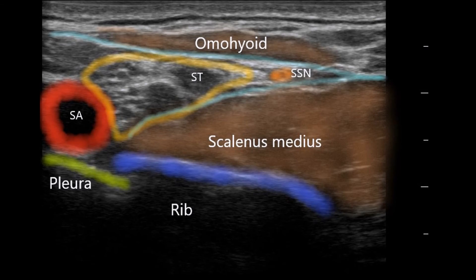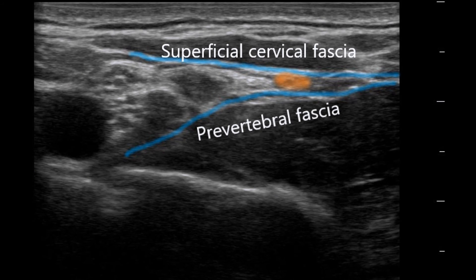This ultrasound image in the supraclavicular region shows the subclavian artery, pleura, rib, scalenus medius muscle, and supraclavicular brachial plexus. The superior trunk is seen splitting, with the suprascapular nerve separating out and traversing under the omohyoid to travel posteriorly. The suprascapular nerve, after splitting from the superior trunk, is sandwiched between the superficial cervical fascia and the pre-vertebral fascia — the injection of local anesthetic is done under the omohyoid and under the superficial cervical fascia to surround the suprascapular nerve.